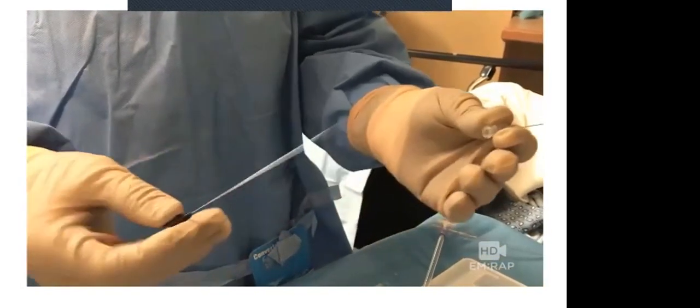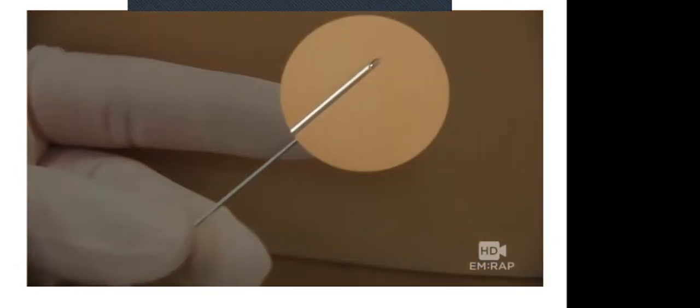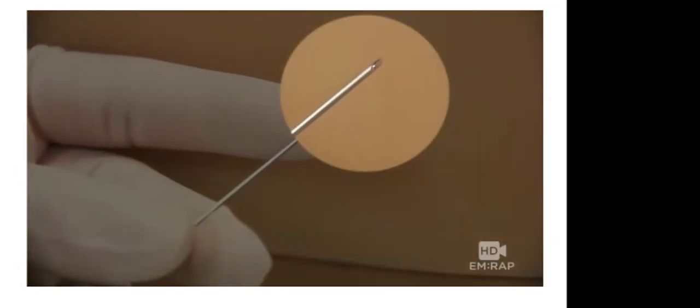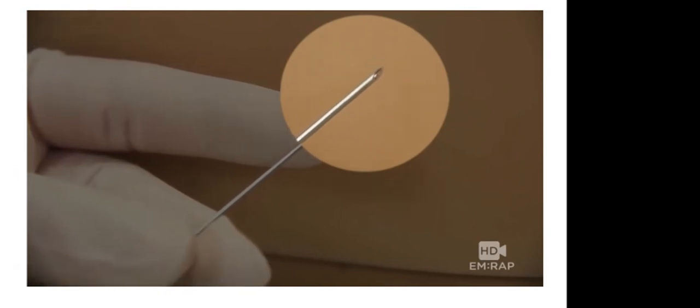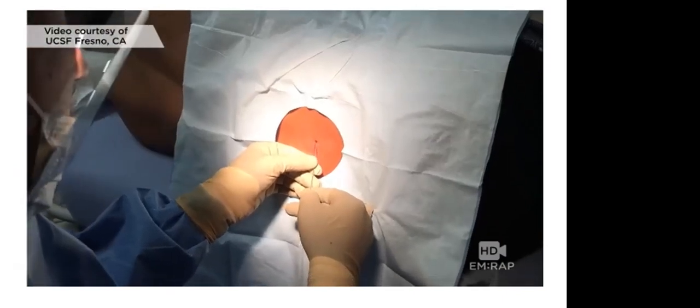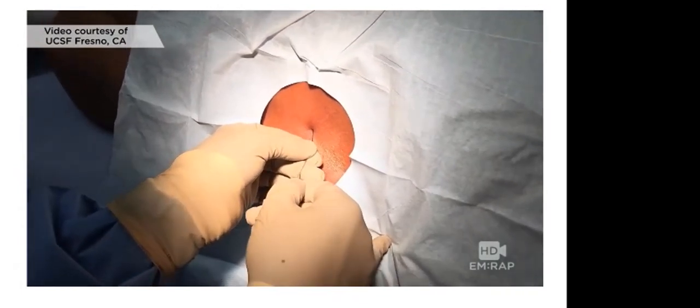Spinal needles come with a stylet in place. The bevel should be oriented longitudinally with the dural fibers. So if the patient is lateral, the bevel is up. And if the patient is upright, the bevel is to the side. Try to stay midline and imagine that you're aiming right towards the umbilicus, or the belly button.